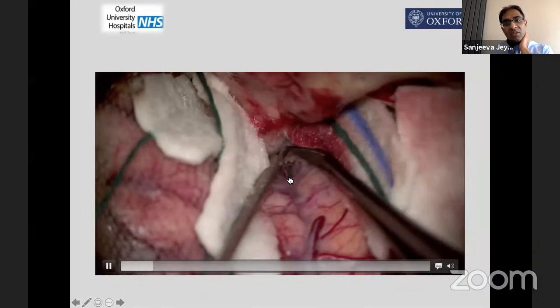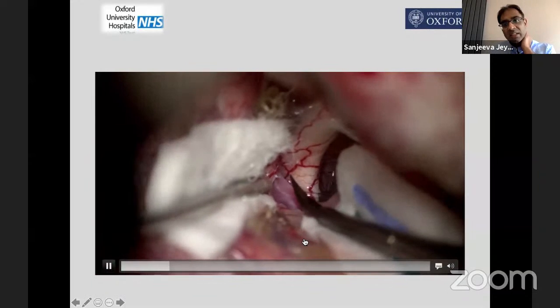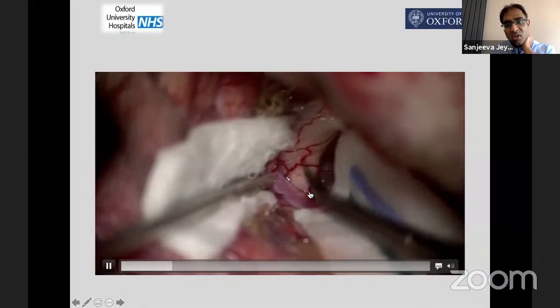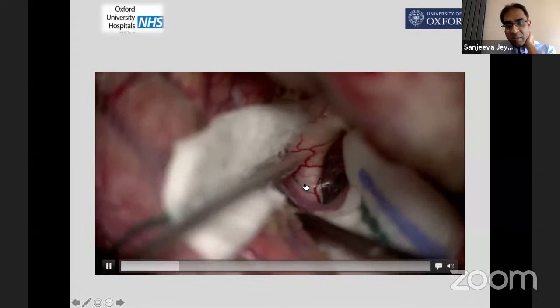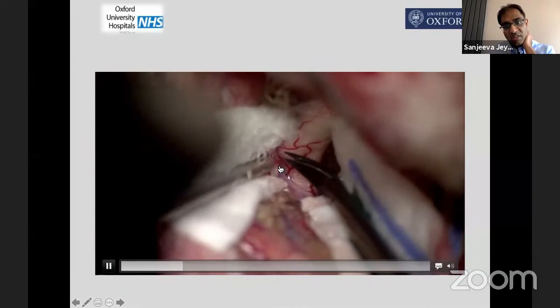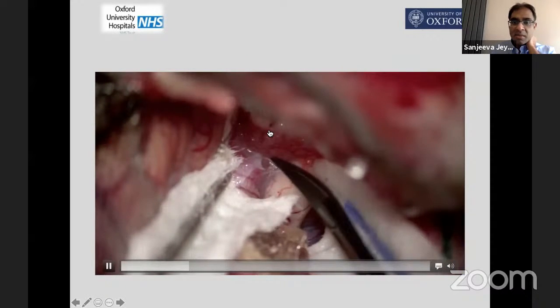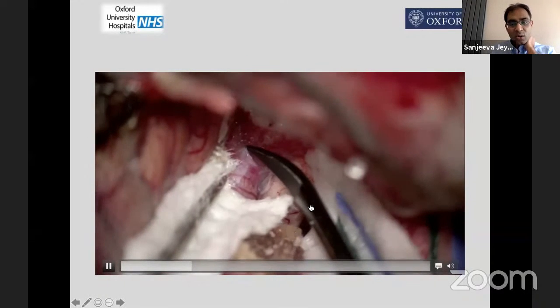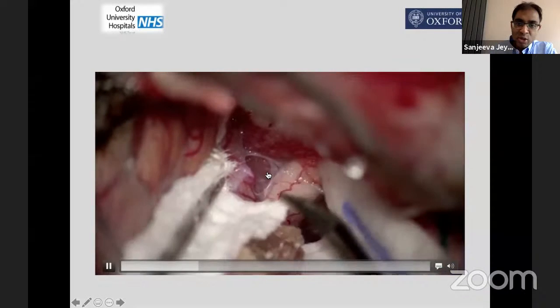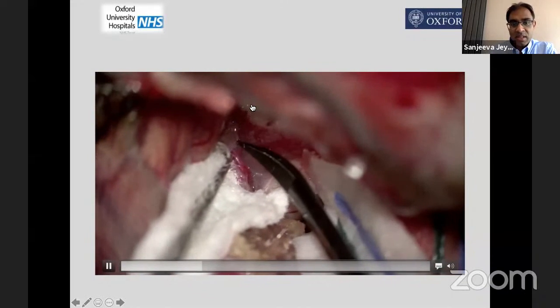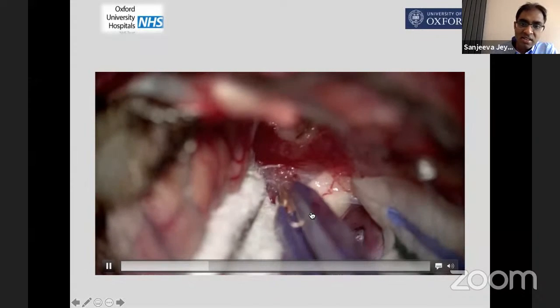Here we're disconnecting the brain as tumor comes into view, draining CSF the whole time — the brain is just relaxing down nicely. Take your time, carefully open, take the brain away so you can start moving it backwards, and that gives you lots of space to start working on the tumor. As you debulk and drain CSF the operation keeps getting easier and easier.